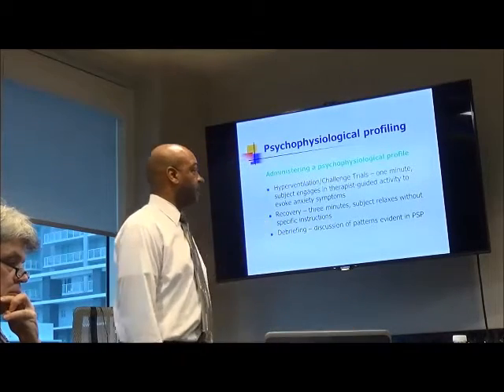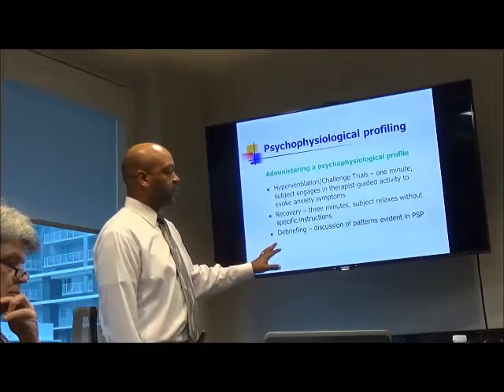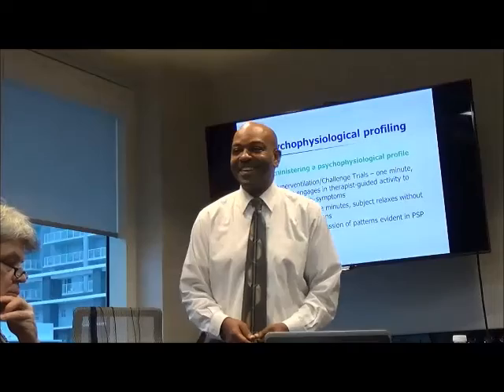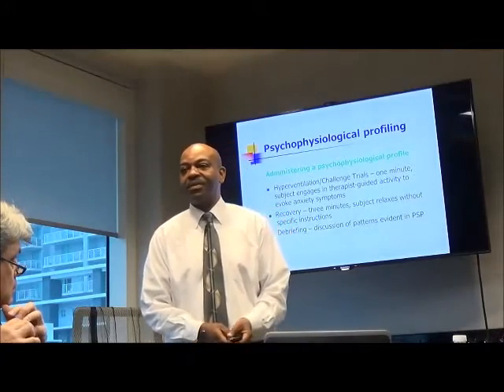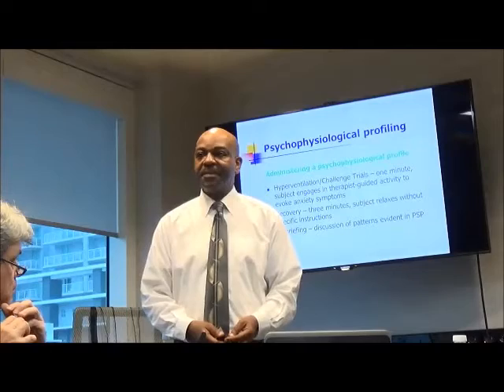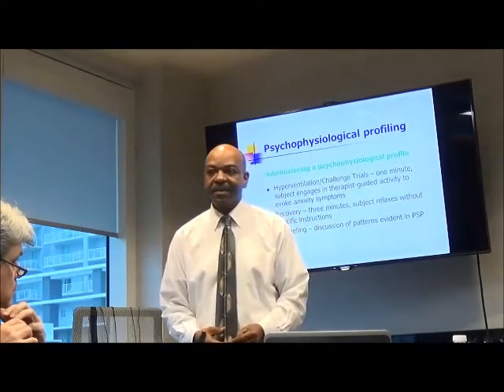Right. And then you have recovery and then debriefing. Debriefing sounds very military, but mainly that's to explain what we did and the results. It's a great opportunity to engage the patient, because the patient has seen the changes and gets motivated for treatment and so forth. Exactly. The debriefing is an essential part.